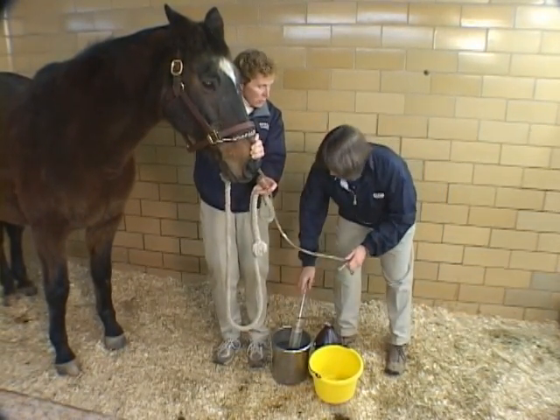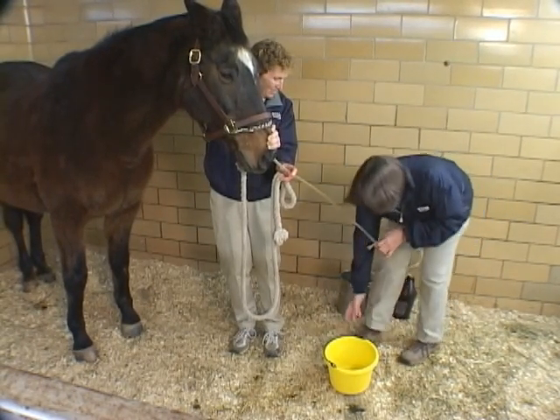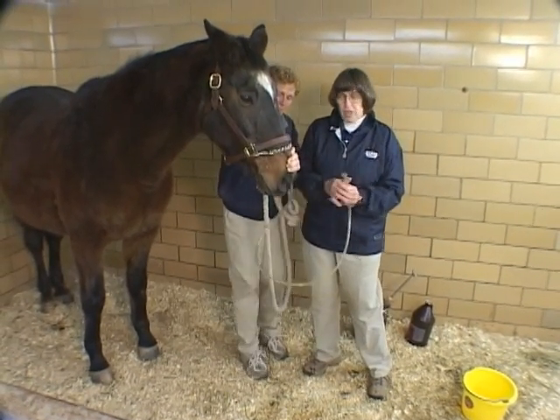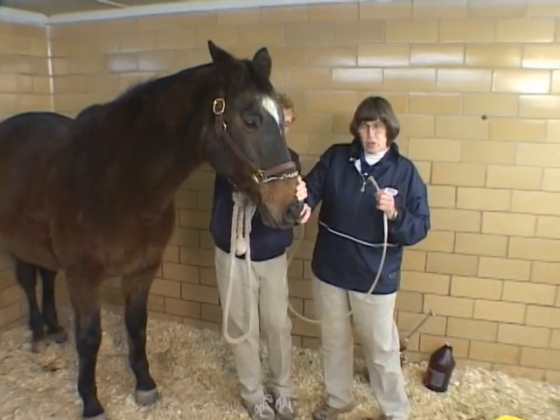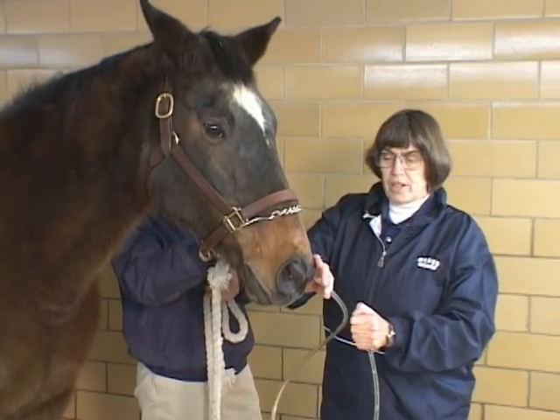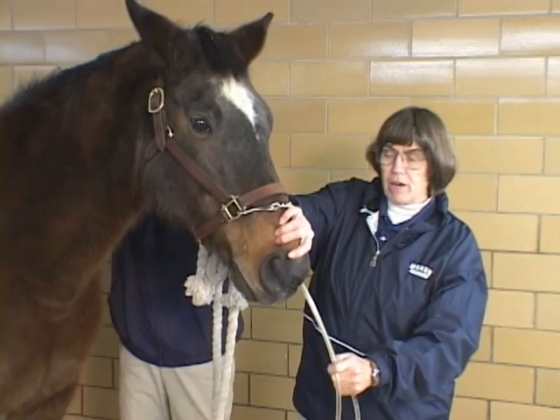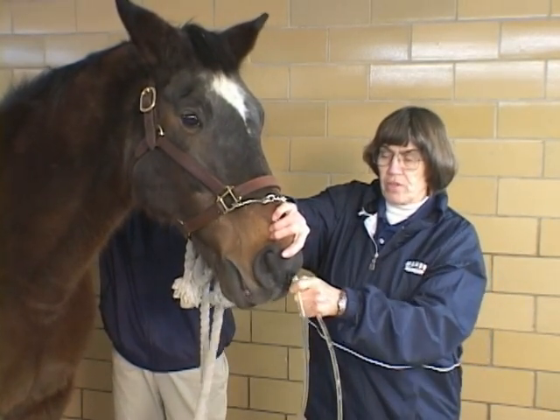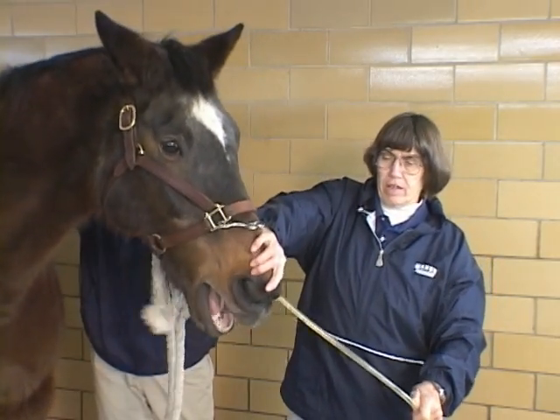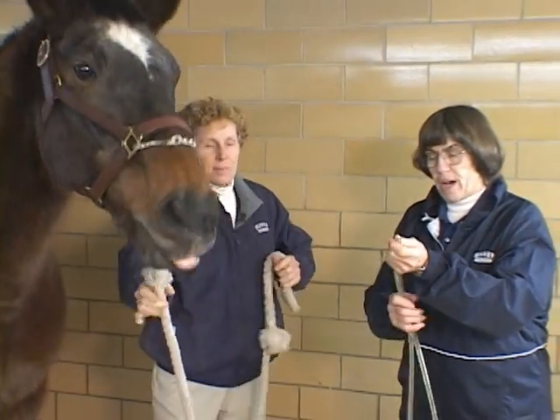We're just about ready to take this tube out — Leroy thinks it ought to come out. When we do this, usually I'll put a little bit of air down the tube to clear it, or blow on it like this to clear the tube. I want to have good restraint on the head, and I'm going to pull the tube out in a smooth action. It's very important to keep the horse restrained at this time so he doesn't fling his head about any more than absolutely necessary, so that we get the tube out in a smooth action.